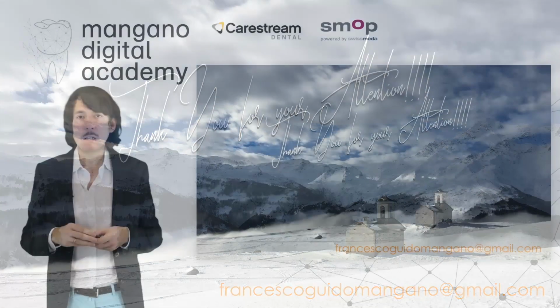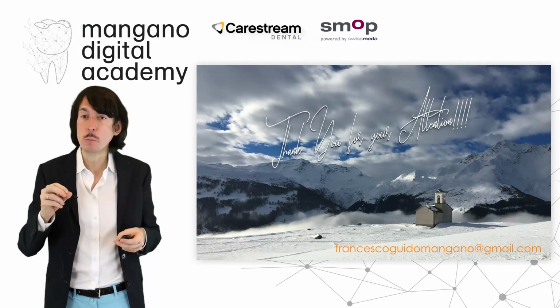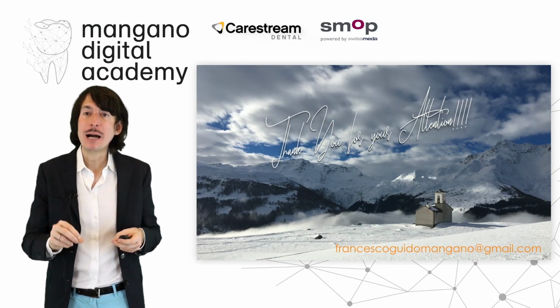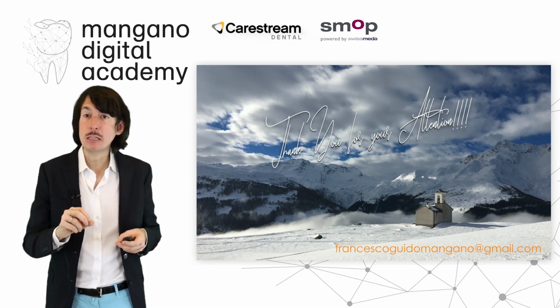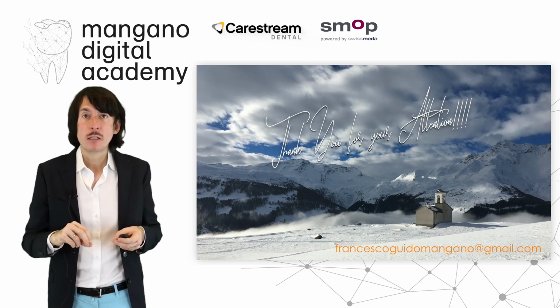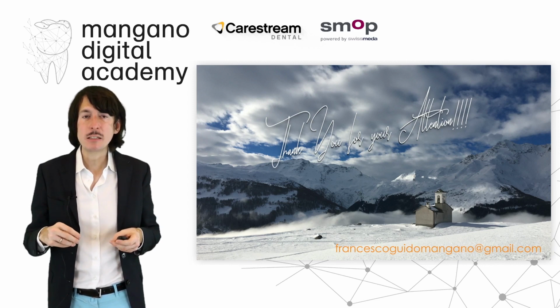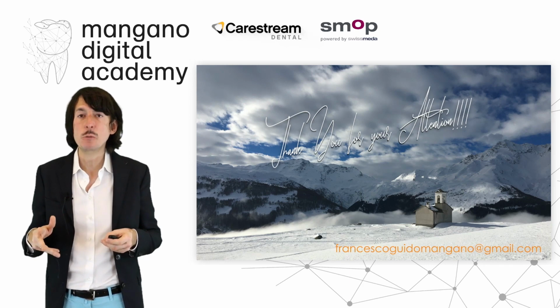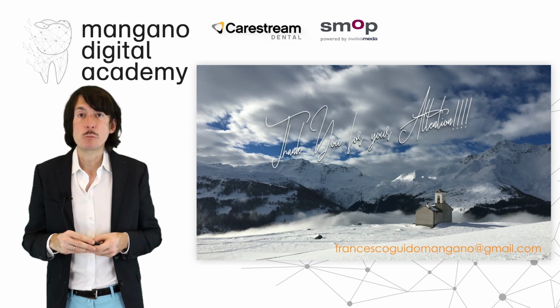Now it's really possible to design in computer-assisted design software and to print excellent bite splints for many purposes: orthodontic purposes, purposes for temporomandibular joint treatments, for gnathology. It's a very fascinating field that is developing very fast, with an improvement of the materials that has been incredible in the last months, and I think we will see more improvement in the next months and in the future.